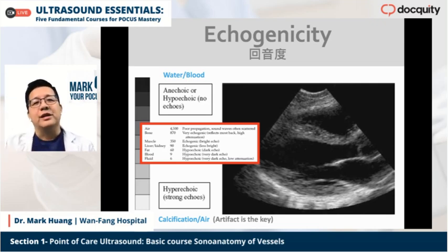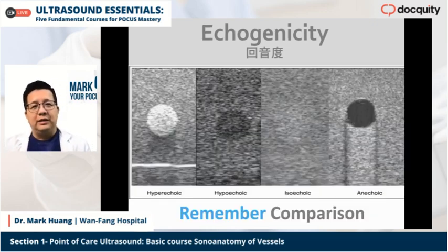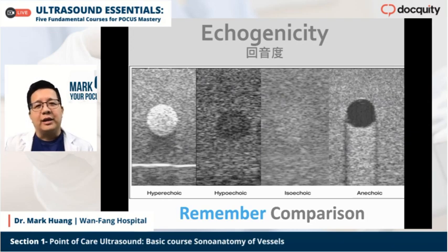So it's a difference. If in the future I have the chance, I will talk about some very basic image concepts. I will introduce the artifacts and spend some time explaining them. Okay.